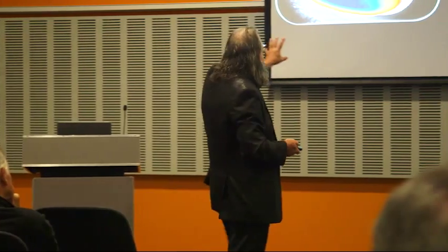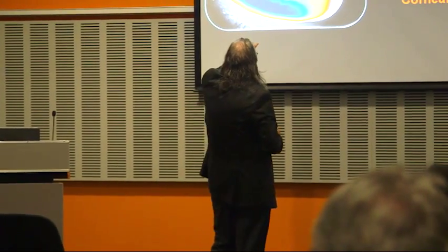Because we do see that in our lower astigmats, this rather significant amount of discrepancy between the two meridians. So suffice it to say that there's a significant amount of toricity in the sclera, and this builds a very strong story for putting toricity into the back of our scleral lenses.